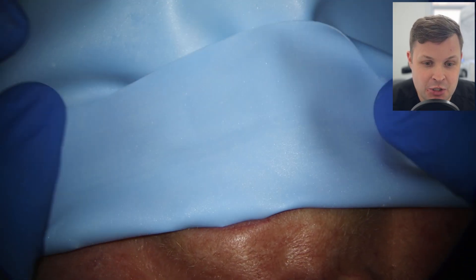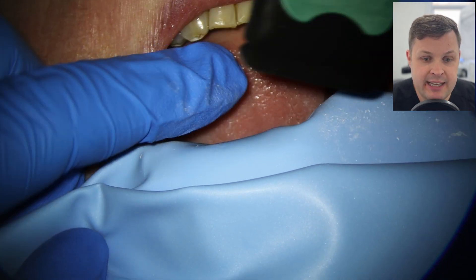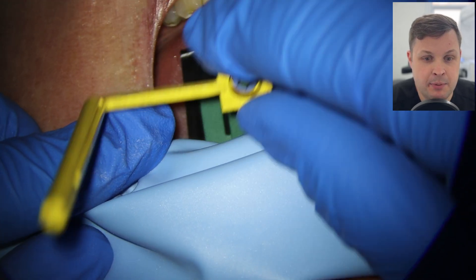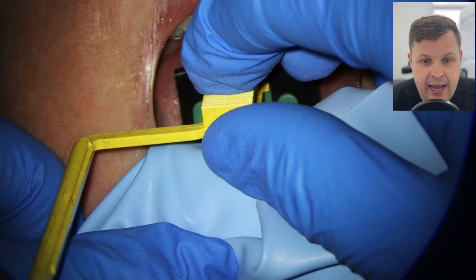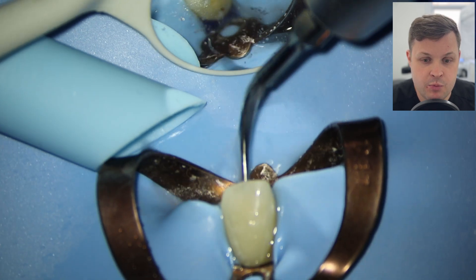I fold the rubber dam back so I can see the clamp, get the patient to open really wide, place the X-ray film holder, and get the patient to bite down gently. When we look at the X-ray, it's relatively nice. With a critical eye, there is extrusion of the sealer, but we're using a bioceramic and I'm not overly concerned — the patient has been consented about this risk, and bioceramic sealer usually resorbs and doesn't cause any bother.